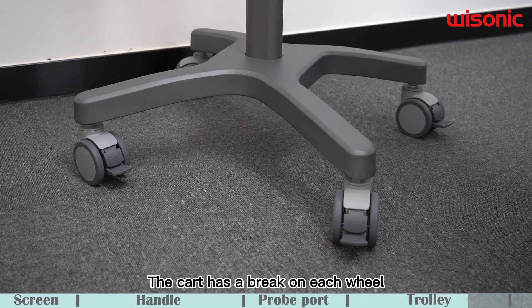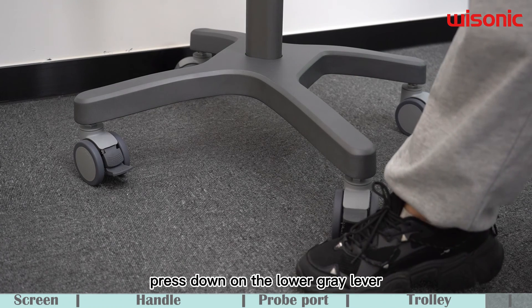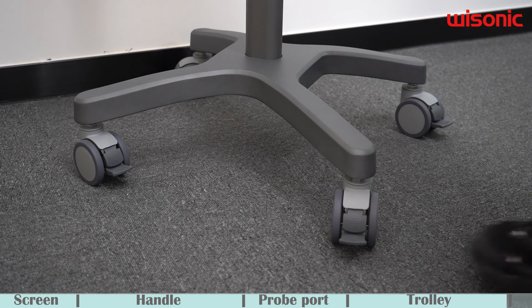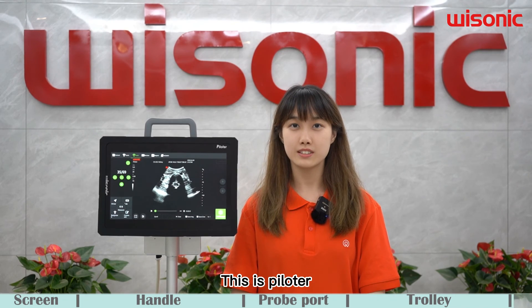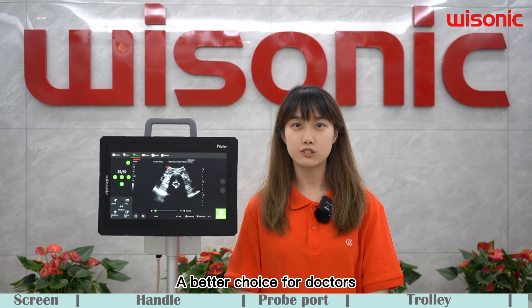The cart has a brake on each wheel. To activate the brake, press down on the lower grey lever. To release, press the top grey lever. This is Piloter, the cutting-edge tablet ultrasound — a better choice for doctors.